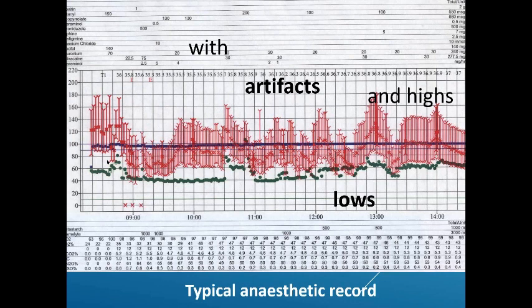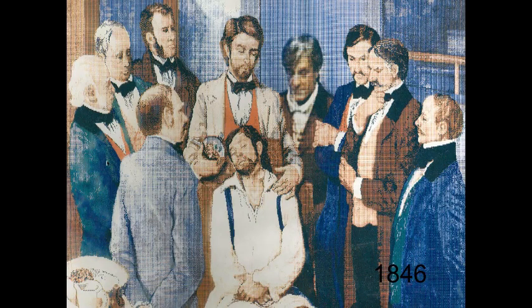EDDI makes a great partner with Safer Sleep. Safer Sleep checks the drug administration, amongst other things, and EDDI provides early diagnostics of adverse events. Things have changed a lot since I started, but we still have a long way to go.